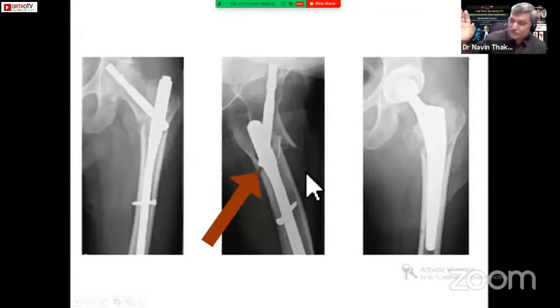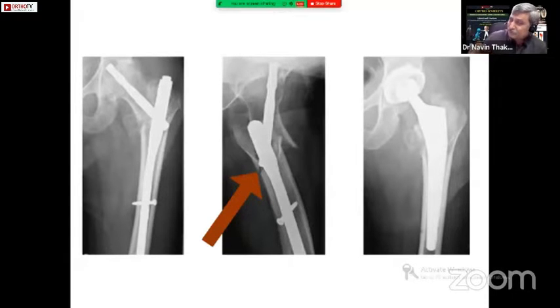But still there will be a varus. Two degrees of varus locked the system. That doesn't allow collapse. And so the toggling with the instability, which is the invisible instability, many times we do not see the posterolateral instability, particularly in the elderly, with the low musculature, which doesn't give a support. That is the problem. Sir, another case, Navin.